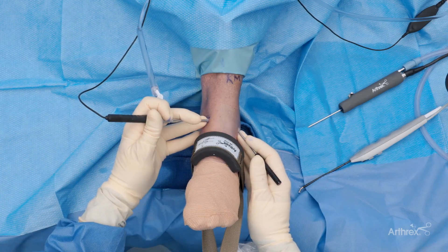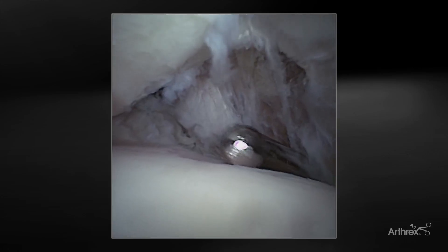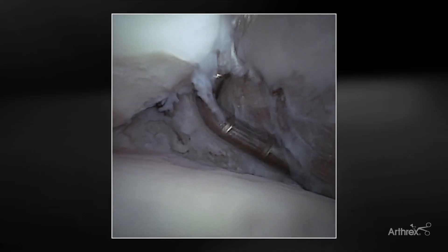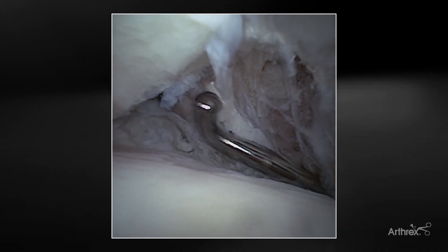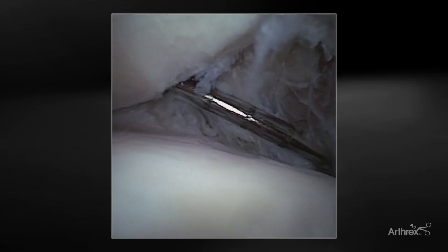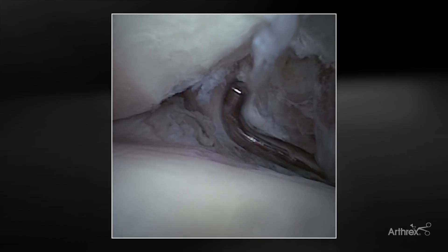The first thing we do when we diagnose athletes with a high ankle sprain is perform a diagnostic arthroscopy. I utilize nano, and we can look around inside the ankle and clearly visualize the anatomic structures. Coming over to the syndesmosis, we use a small joint probe and evaluate the fibula, distal tibia, and talus. We can see in this patient that the AITFL is attenuated and torn. This backs up our diagnostic examination. We can also do a fibular translation test, translating the fibula anterior to posteriorly, and stick a small probe into the syndesmosis to do a dynamic examination and see if the ankle is unstable.